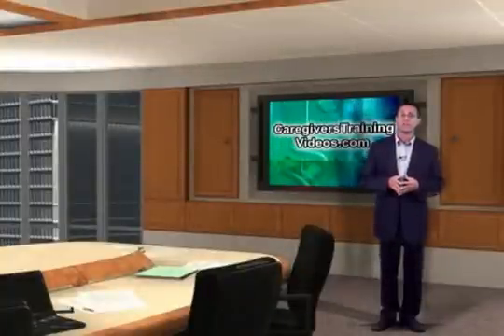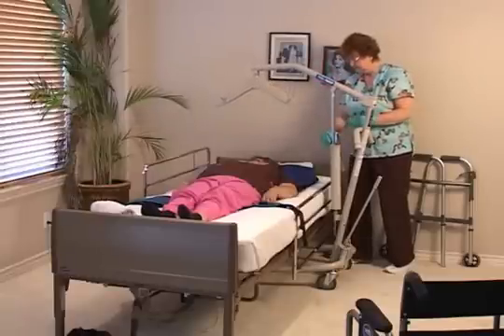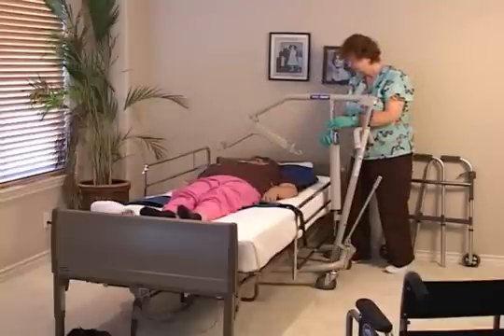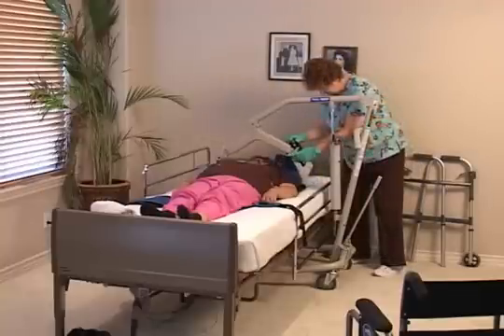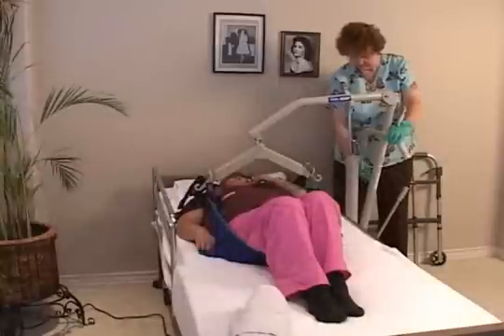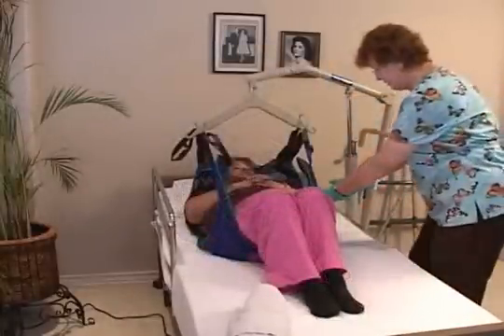21st, steer the lift so that the swivel bar is parallel to the patient's shoulder. 22nd, turn the control valve to release the hydraulic pressure to lower the boom and swivel bar. Then secure the control valve. 23rd, attach the sling loops to the swivel bar and give the lift a few pumps to provide tension to the sling. Ensure the sling is attached to the swivel before lifting the patient.